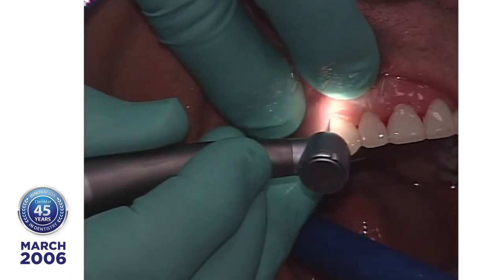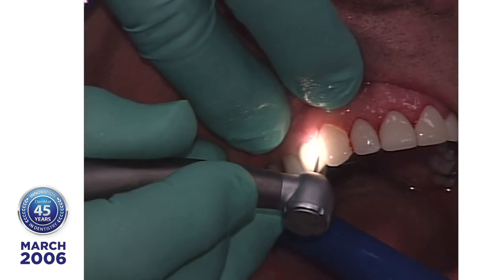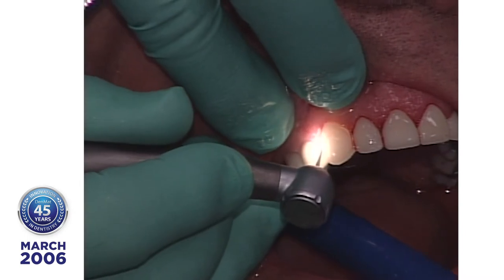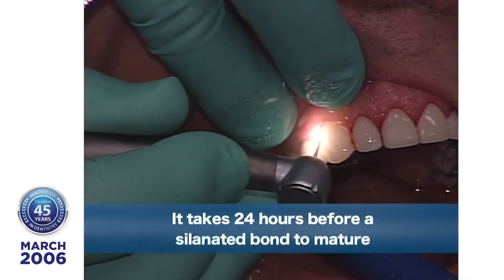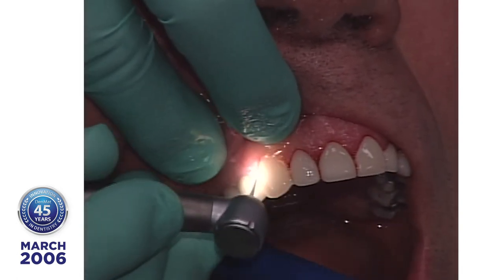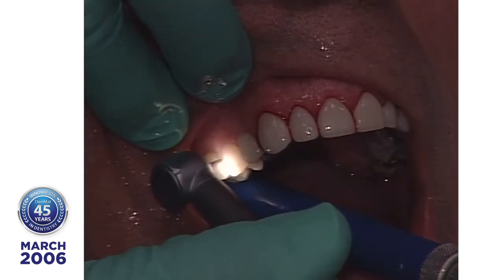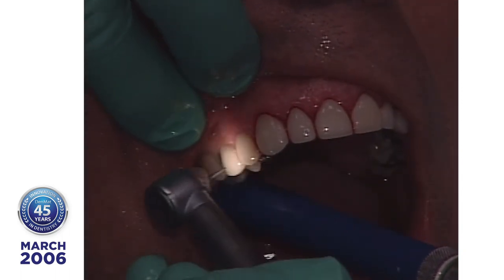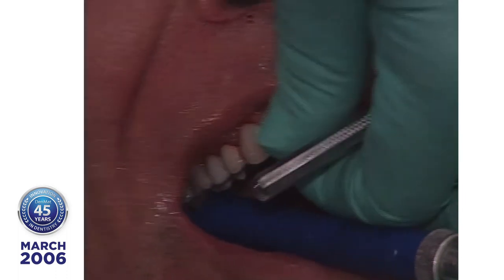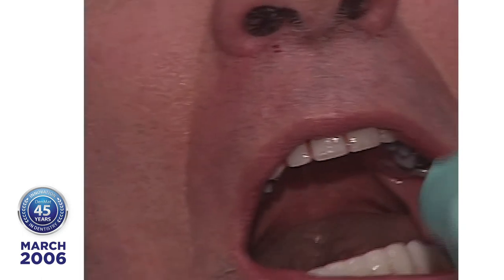Now, a little tip about bonding to porcelain, it's different than bonding to enamel. And the little tip is this, that it takes about 24 hours for a silanated bond to mature. So I never try to open the contacts where I bonded porcelain on a porcelain crown. And I wait at least 24 hours before I try to open that embrasure. And I don't try to open them all on the same placement visit.